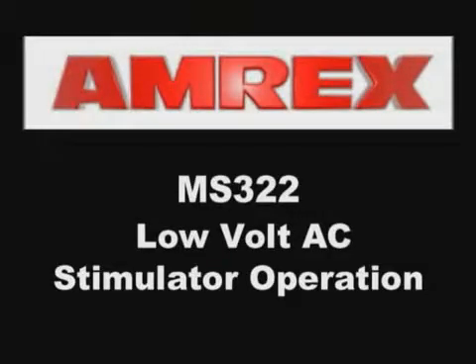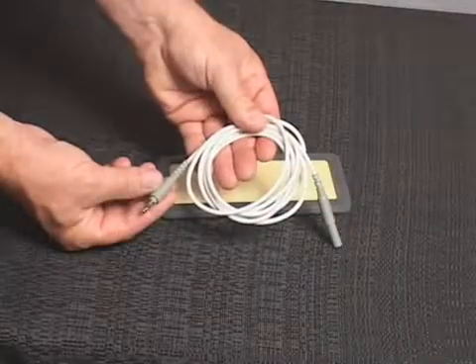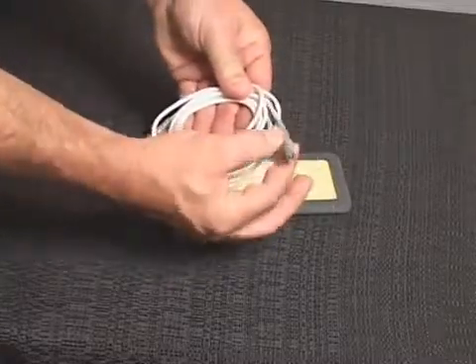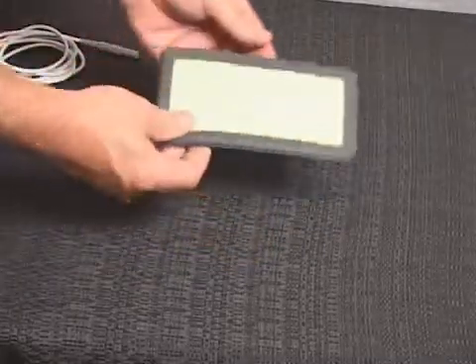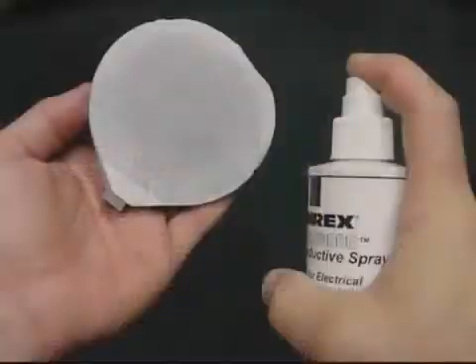MS322 low volt AC stimulator operation. The patient leads should always be checked for proper connection and damage or deterioration prior to treatment. Loose connections or damaged cables can cause low stimulation output, no stimulation output, or sudden irregular increases in output, resulting in possible discomfort to the patient.